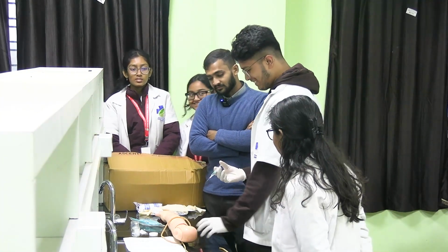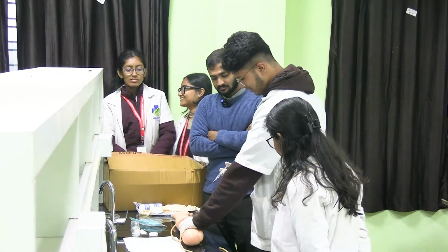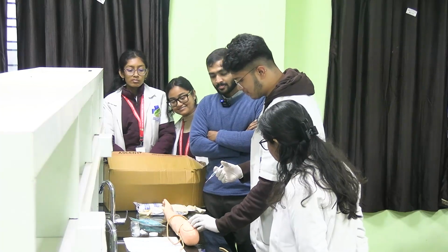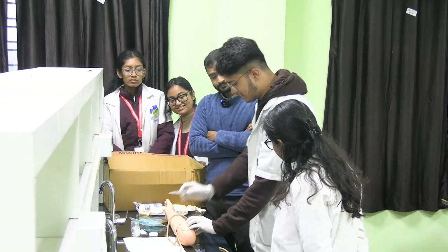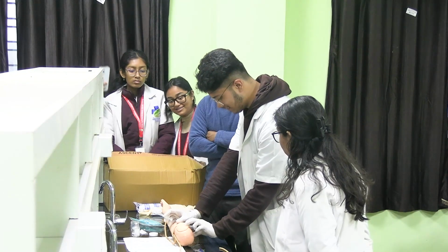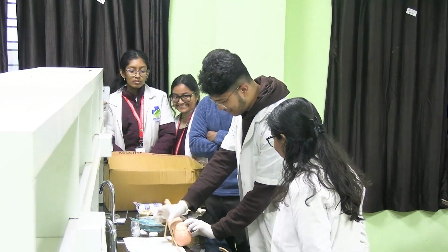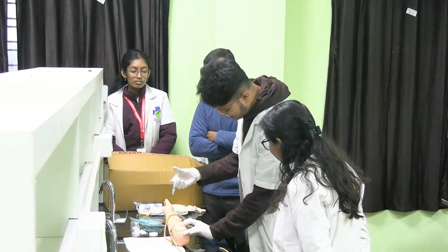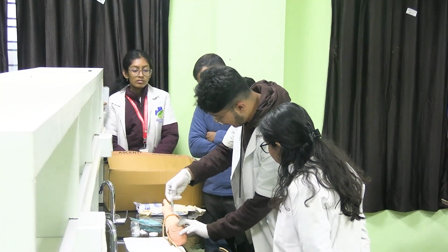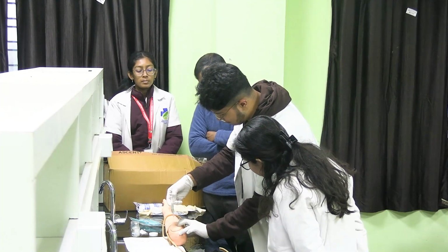Okay. Where is the muscle? Here is the muscle, sir. Then I will pull the muscle laterally, sir, two fingers. And then look at the spot, sir. I'll make sure that it is 90 degrees, sir, perpendicular. While inserting, I'll make it fast and firm.